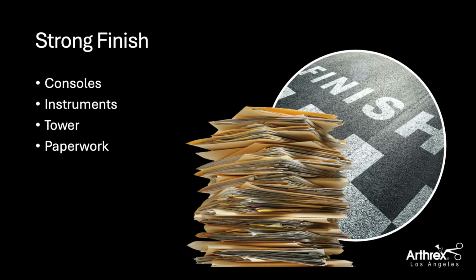Congratulations, you finished your first case. It's important that we tear down and remove everything that we put on the tower and also the instruments that are in the field. The first thing we really want to talk about is the console.